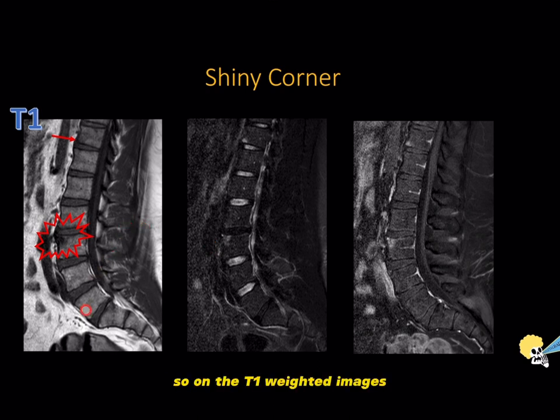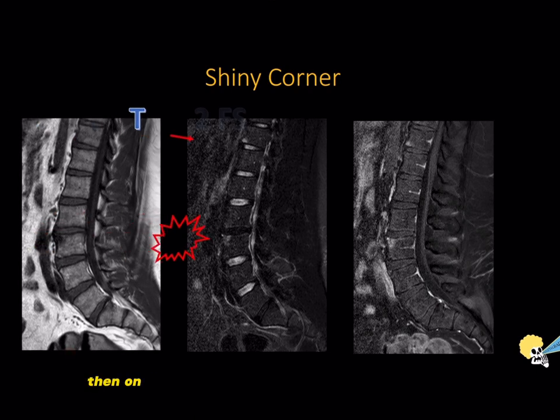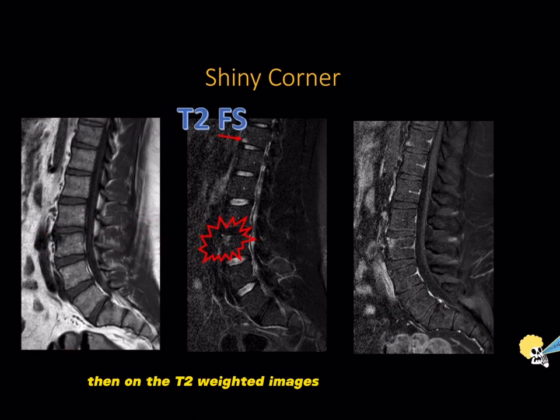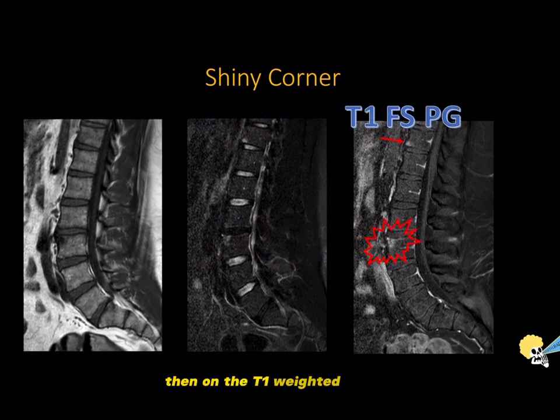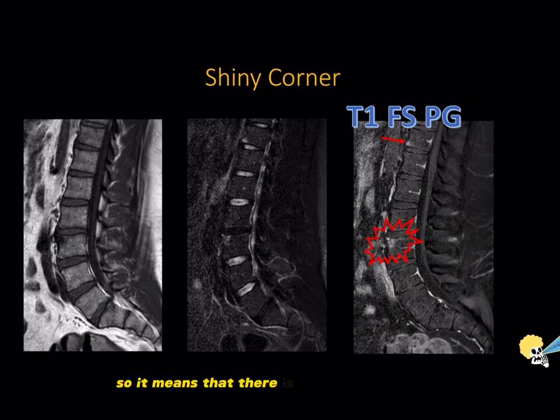On the T1-weighted images we see low T1 signal intensity. On the T2-weighted images with fat suppression we see increased T2 signal intensity, which is related to bone marrow edema. On the T1-weighted images with gadolinium and fat suppression, the lesion is bright, meaning there is active inflammation.